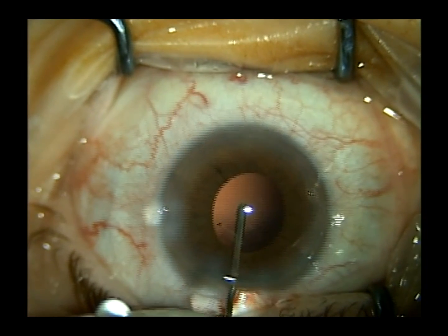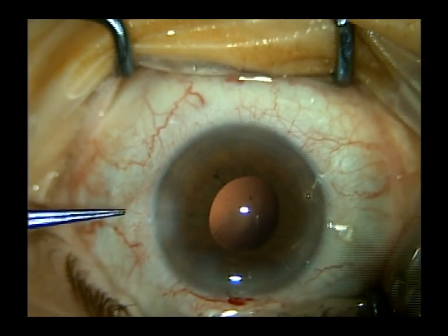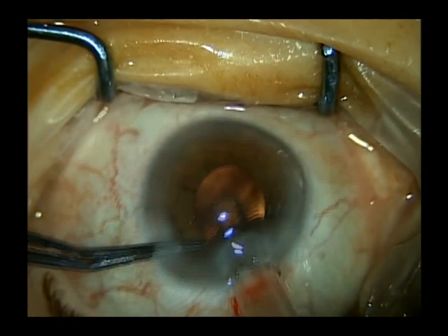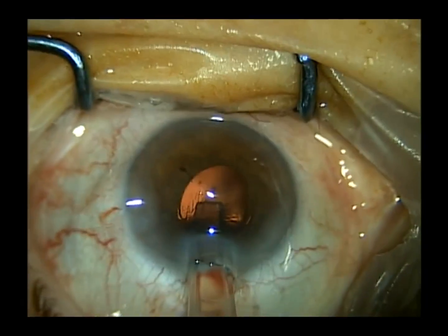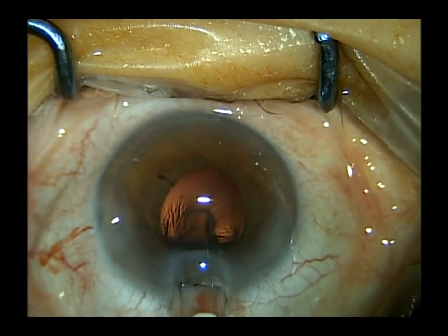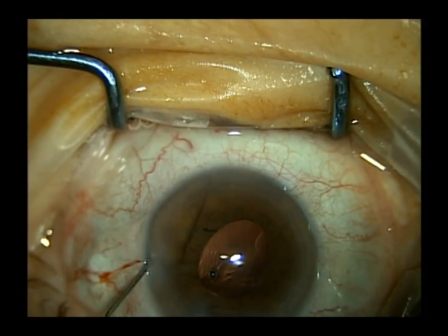So now we've safely removed the cataract. Our pupil now looks to be about 4 millimeters in diameter. We fill the eye with more viscoelastic. I use a Bausch & Lomb Li61 AO lens, and I insert it into the capsular bag. This is an excellent insertion system because it allows ease of insertion of the IOL into the capsular bag, all with the insertion system. So we get the leading haptic, the optic, and now the trailing haptic all in the bag in essentially one motion, which is really nice.